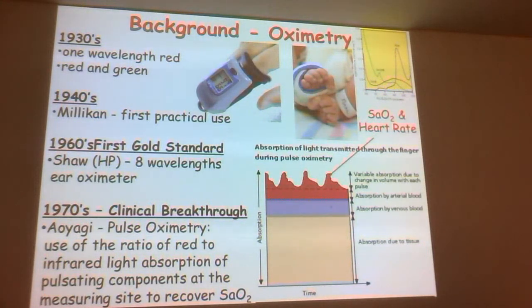The problem was they were always confounded by scattering, and they needed some way to calibrate scattering, because the scattering would change the path length of light through the tissue, and the scattering was wavelength dependent, and they didn't really understand what that wavelength dependence was and the impact it would have on the path length, and so they couldn't ever really accurately calculate the oxygenation.